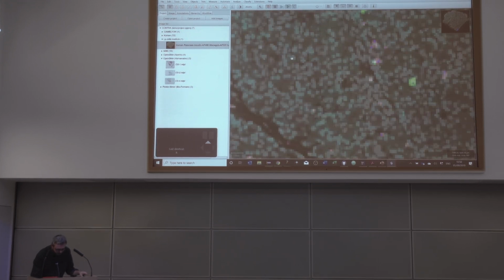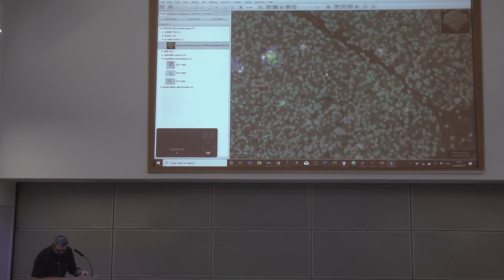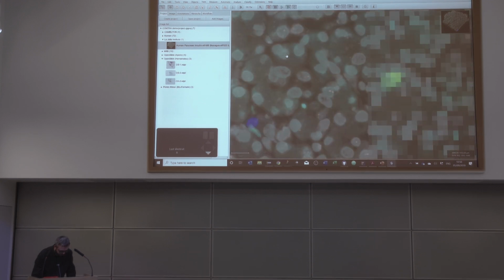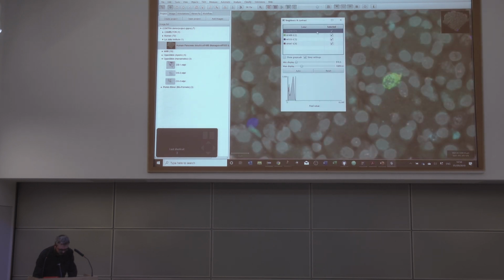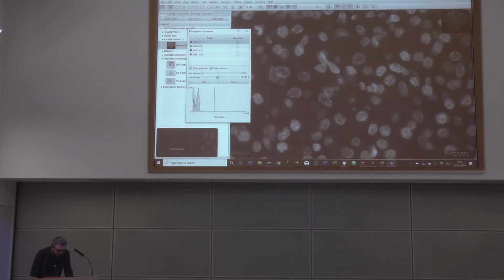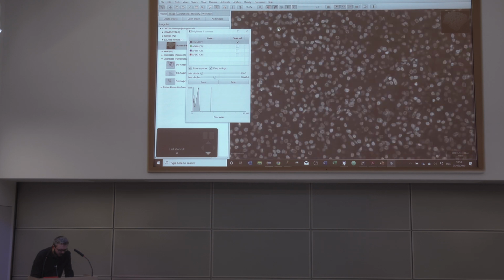So here I'm moving into a fluorescence image. I gave a workshop at the La Jolla Institute, and they generated a lot of really nice data sets. So this is one of theirs. So here we have a fluorescence image. I can turn channels on and off. And let's say I'm going to want to go to the nucleus channel. I'll view it grayscale. And let's say I want to come up with a cell detection if I'm not happy with QuPath. So I can apply this magic wand, which will adapt to whatever resolution I'm at.